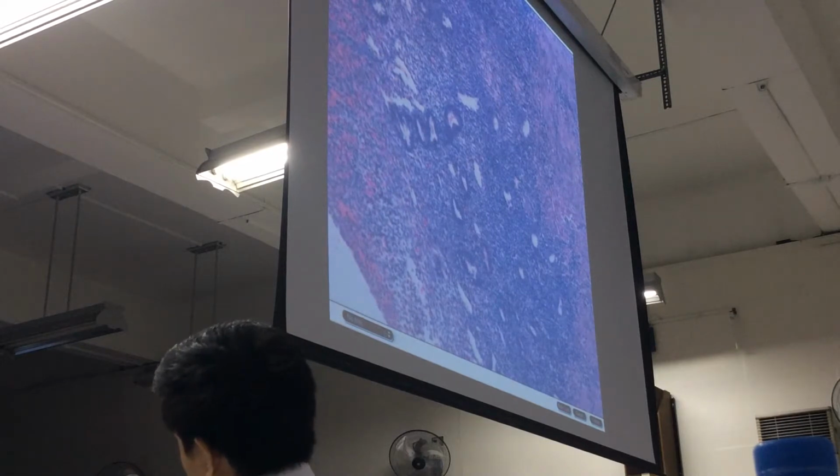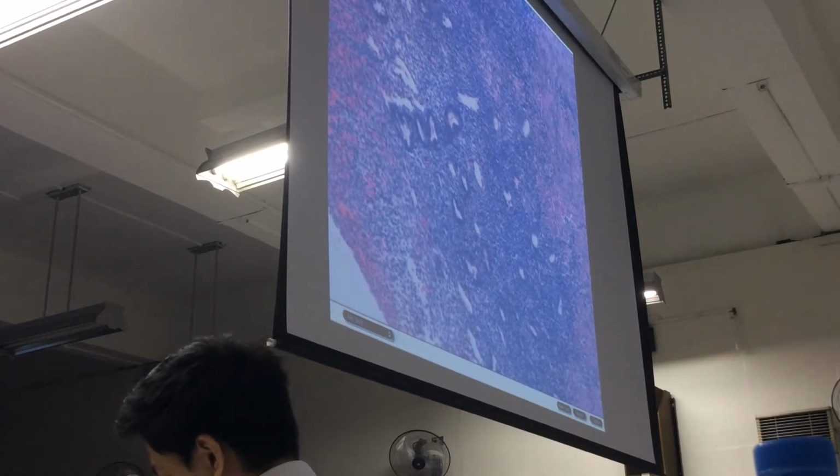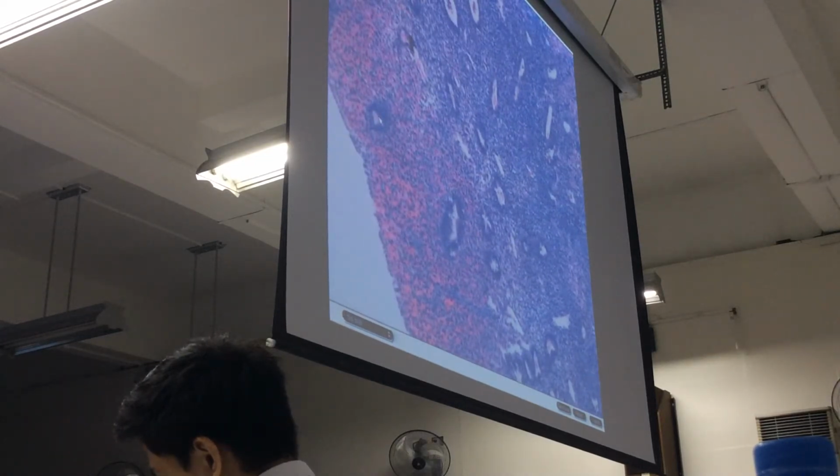Look at the endometrial glands in that part. The endometrial glands coming from the base, going up to the superficial portion, or the functioning endometrium, are relatively straight, tubular and round. Okay, that's seen there.